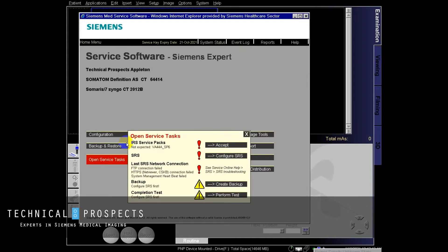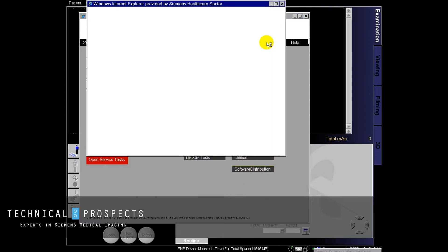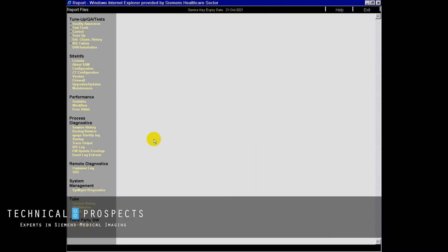And once our service software opens up, we're going to go to reports. On the left here, you'll see tube. And to record our tube history, we'll go to all histories.